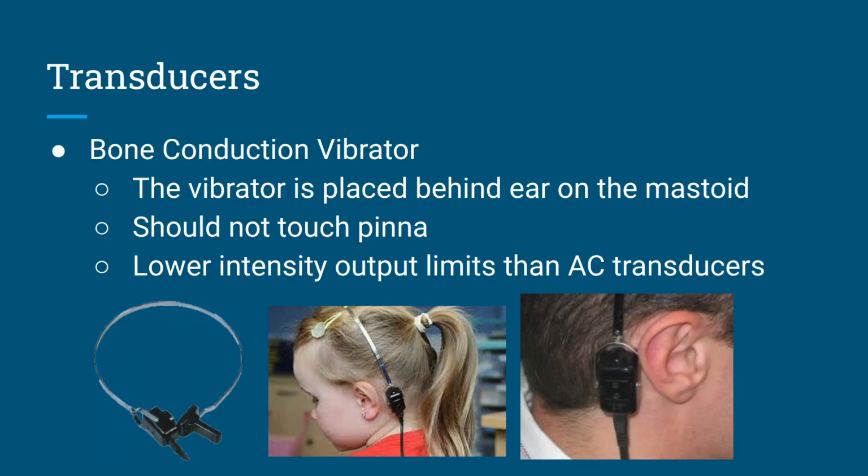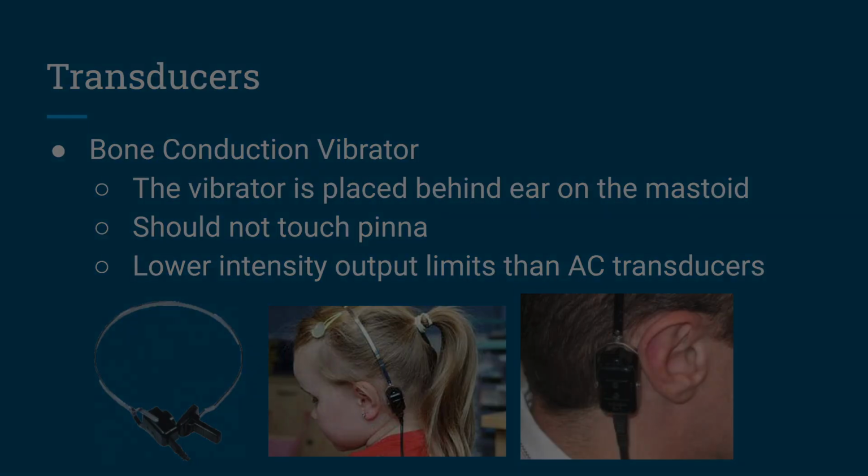What I mean by vibrotactile stimulation is you can feel the response instead of hear the response, and the patient is not always reliable at telling you which is which. So that's something to be aware of.